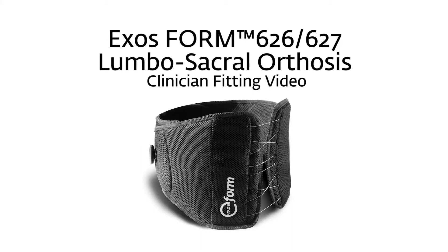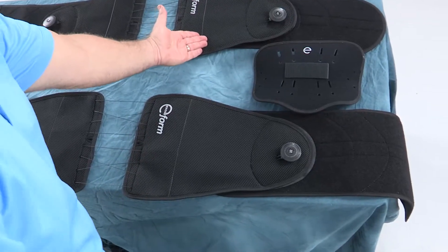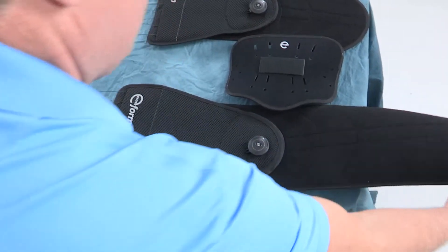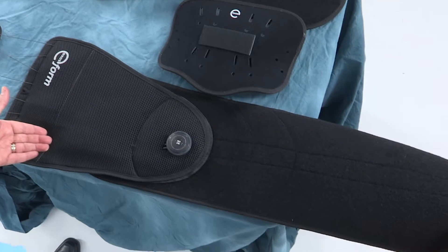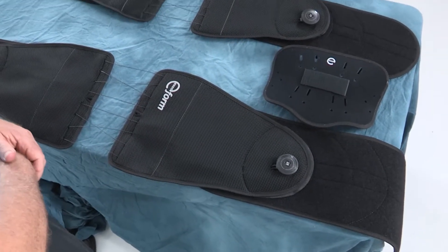This video demonstrates the application and fitting of the ExosForm 626 and ExosForm 627. The ExosForm spine bracing system is available in two sizes: a small-medium size and a large-extra-large size. The small-medium size will fit the majority of your patients.